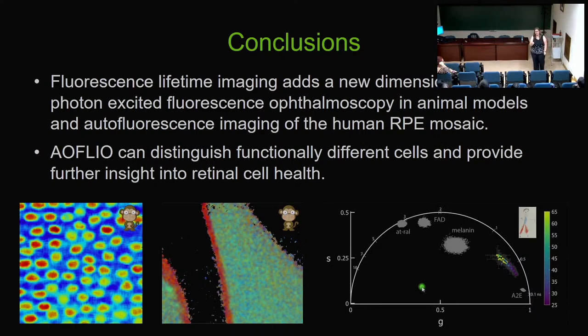And so concentrations of fluorophores can, depending on what your target is and what your goal is, really play a role and can confound what you're trying to look at. And so then you have to start getting creative about how you're going to analyze the data and how you're going to pull out the backgrounds, and we haven't solved that problem yet, hence that paper's not published yet. But we're working on it, and we have a lot of ideas about how we're going to do that. But I think you just have to be conscious of those factors as you're starting to look at this.